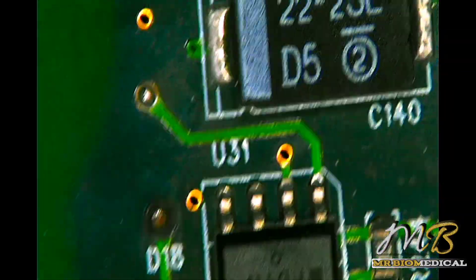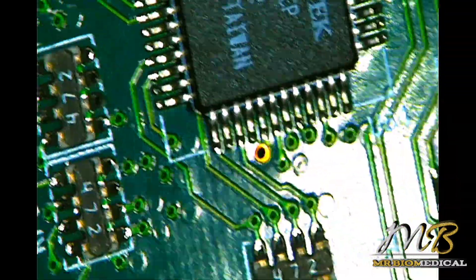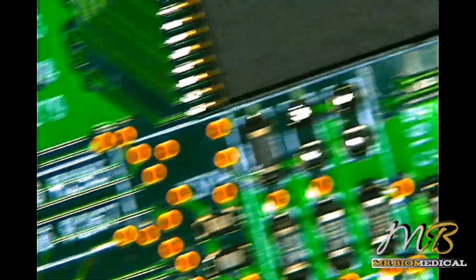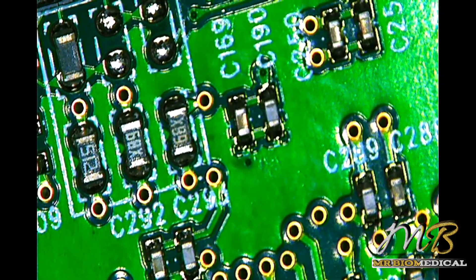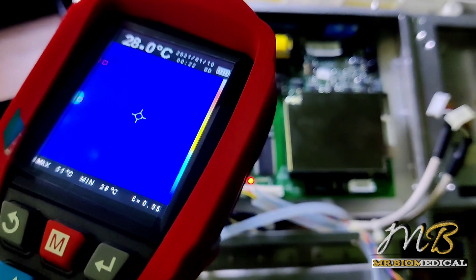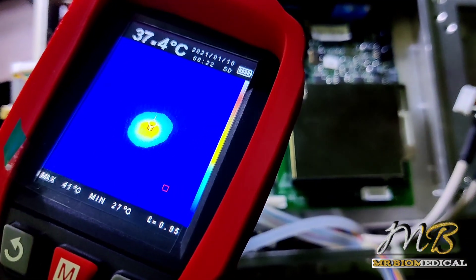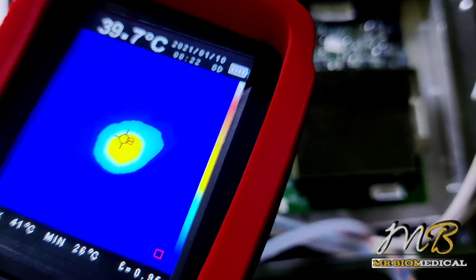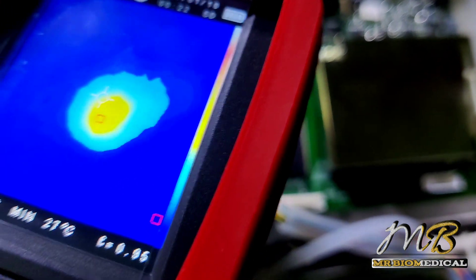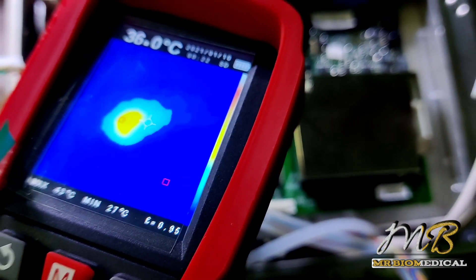Before that, I need to check my thermal camera which I bought yesterday. Let's connect the board into the monitor and see what is happening under the thermal camera. Switching on the unit under the thermal camera — this component is heating up, which means it must be shorted to ground; that is why it is giving a heat signal.